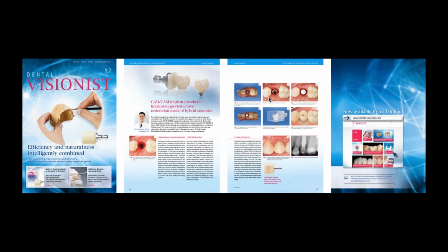I like to have both sizes of blocks in terms of the height, so we could reduce the milling time if this is something that you want to achieve in one appointment. It will be slightly faster if you use the shorter disc, the implant solution, in comparison to the longer one. But you also want to have some of those for cases where the crown could be a little bit long.